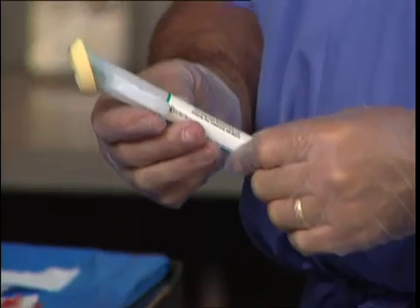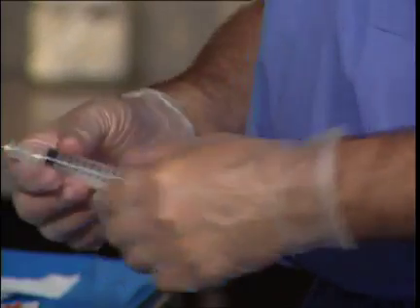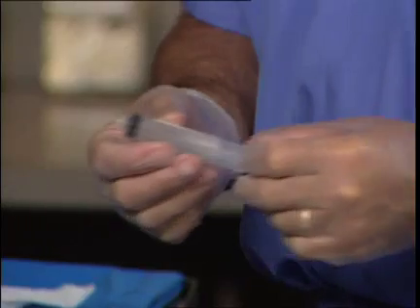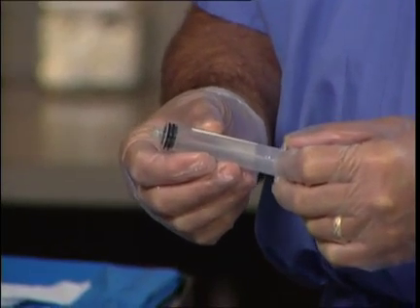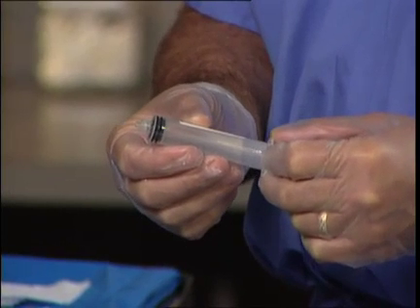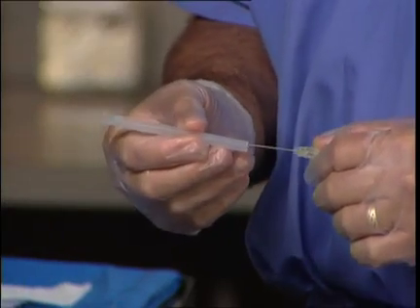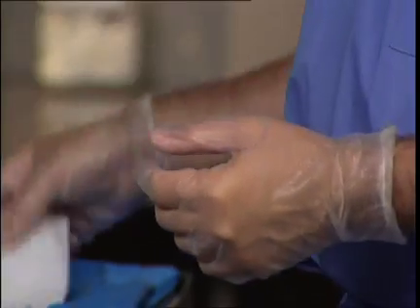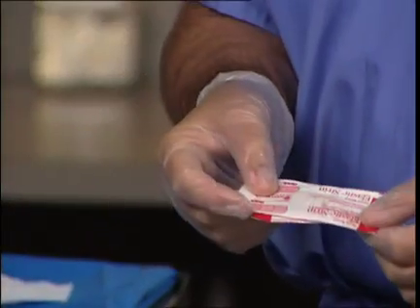To perform this particular block, the following equipment is necessary: chlorhexidine for sterile technique, a local anesthetic syringe containing 1% buffered lidocaine, and then a syringe containing 5 cc's of bupivacaine, 0.5%, mixed with 5 cc's of 1% lidocaine, and then 40 to 80 milligrams of triamcinolone, Kenalog, which is a particulate steroid. A 3.5-inch, 25-gauge spinal needle will also be utilized for the procedure. There will be sterile 4x4s necessary to clean the area at the conclusion, and a simple Band-Aid will suffice to cover the wound. The patient is placed in the traditional prone position.